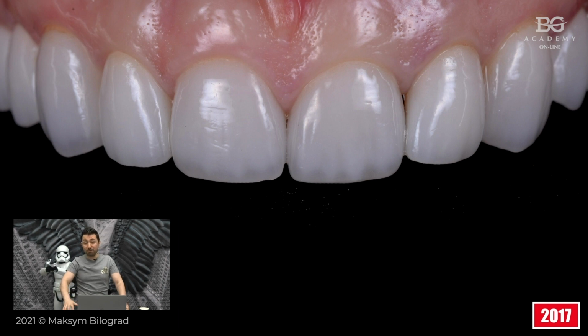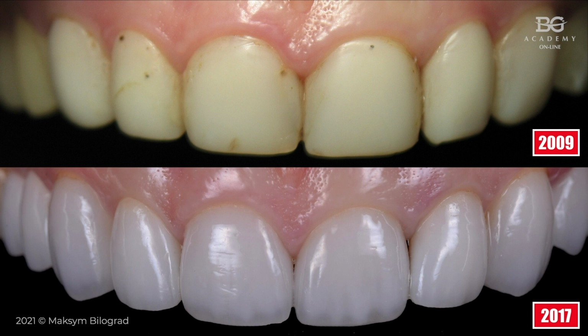And the thing is that after her, we got a lot of patients, her friends actually, with the same request. Please do the case like you did for our friend. We would like to have teeth like her, or maybe even a little bit whiter, if possible. And afterwards, after 2009, I can say that roughly 95% of all my cases are bleach cases, like BL3, BL4 we use for our patients. We make them natural looking, and we highlight the beauty of our patients with whiter teeth and make them happy.